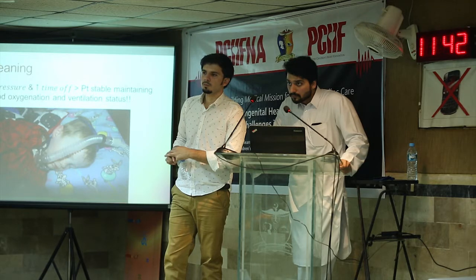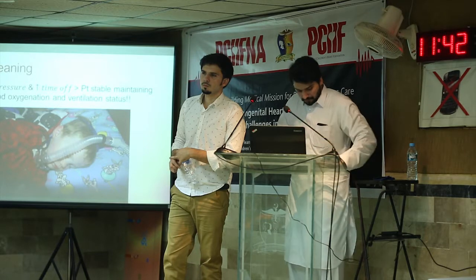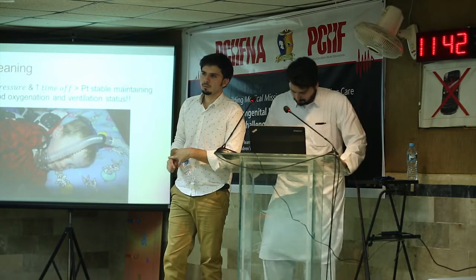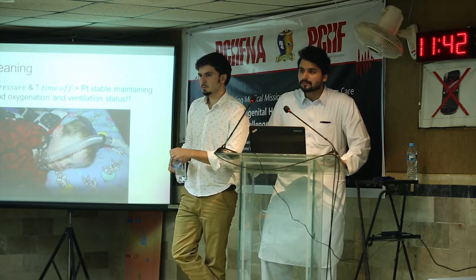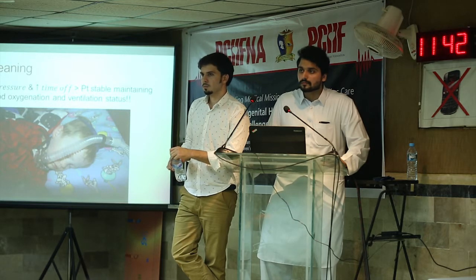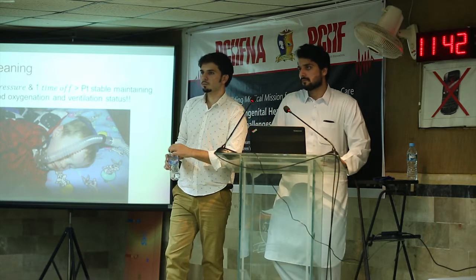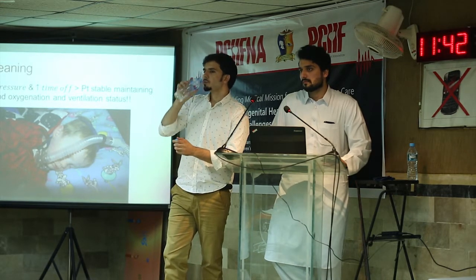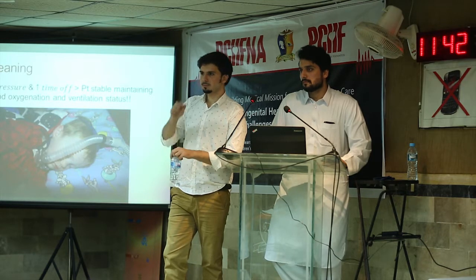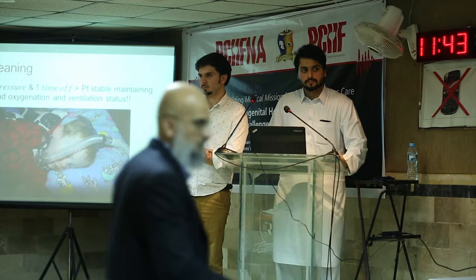I wanted to ask, if we visit once, whether you can look at that, and if that is something we can use or invest in getting. Or the simplest thing would be using that nasopharyngeal tube placement hooked up to a ventilator, which we could do very quickly. Our experience with CPAP and BiPAP, with CPAP especially, has been very variable. Some patients are fighting it, and next thing you know, within 2 hours, the child is looking worse. I don't know, maybe we're doing it wrong. So we need to really be educated on what we are doing wrong and how we can do it better.